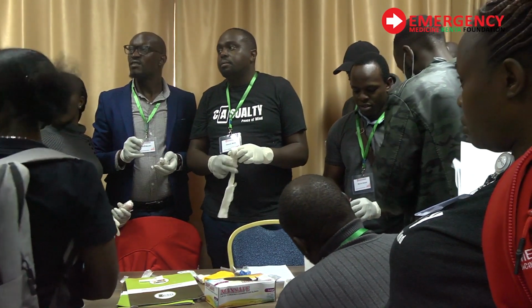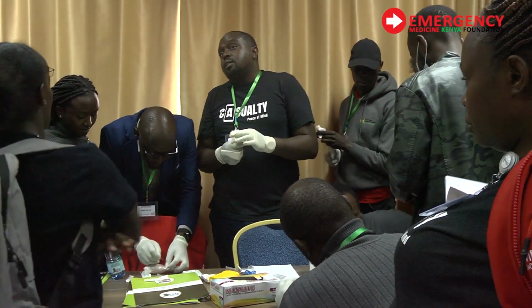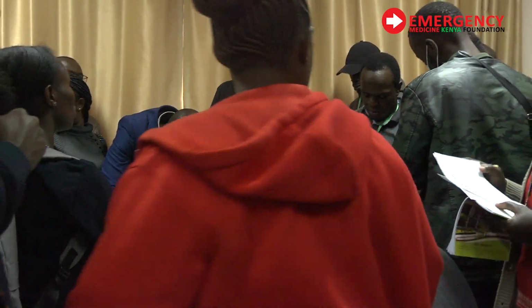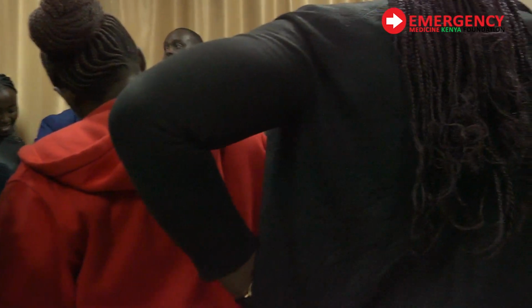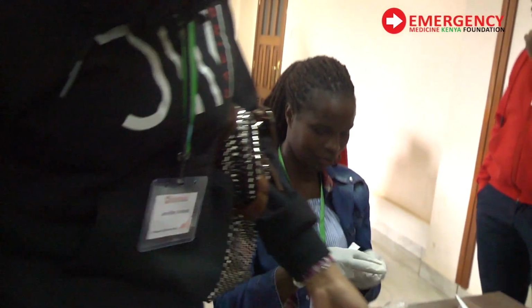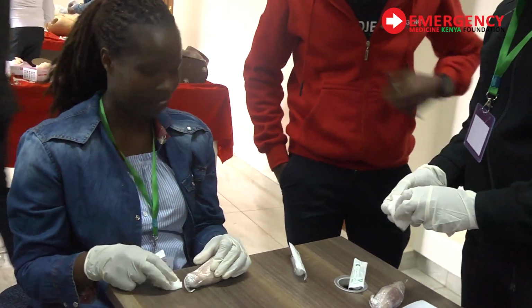What are some of the complications? It depends. You can introduce an infection to the site, because remember you're pricking from the skin into the bone marrow. That's why you need to swab around it before you go in. And the other thing is, you could prompt a fat embolism to occur. So it's something that you need to be aware of and do a wholesome management of your patient. Once you're in and stabilize the patient, if the patient has been unconscious for some time or you anticipate them to be unconscious for some time, you can do heparin prophylaxis just to avoid clot formation and things like that.